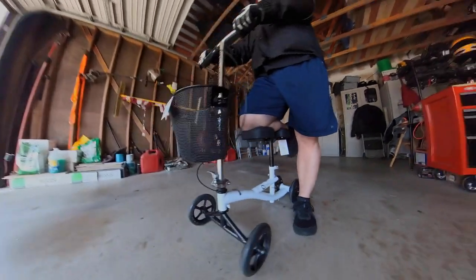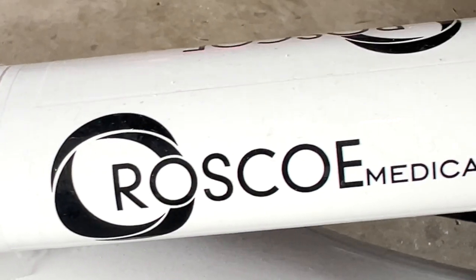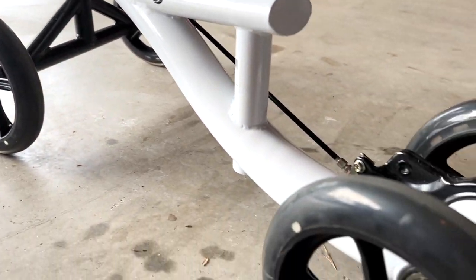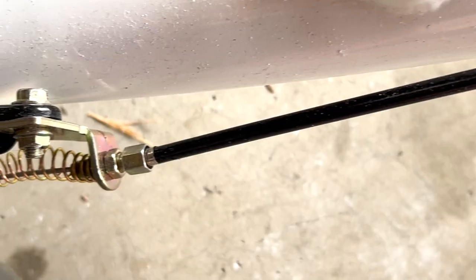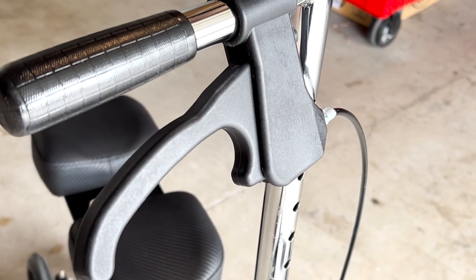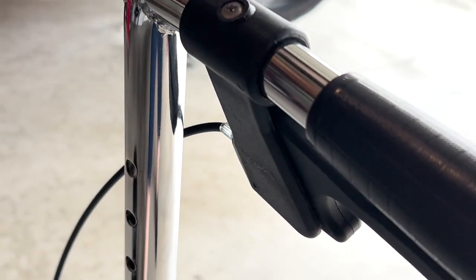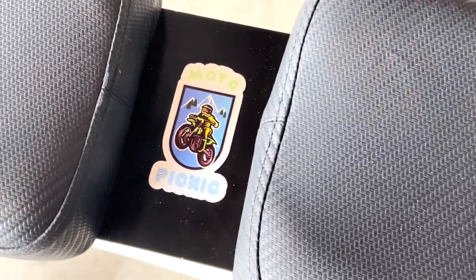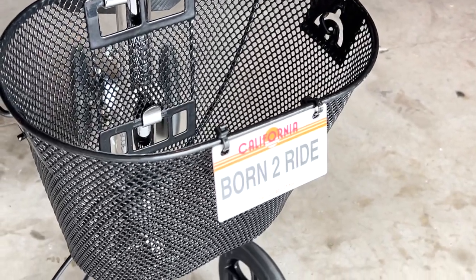Introducing the supportive knee scooter by Roscoe Medical, featuring seven and a half inch wheels front and rear, a single drum brake in the rear actuated by the handbrake, which is attached to the adjustable handlebars. Stylish foam padding featuring a custom Moto Picnic graphics kit.